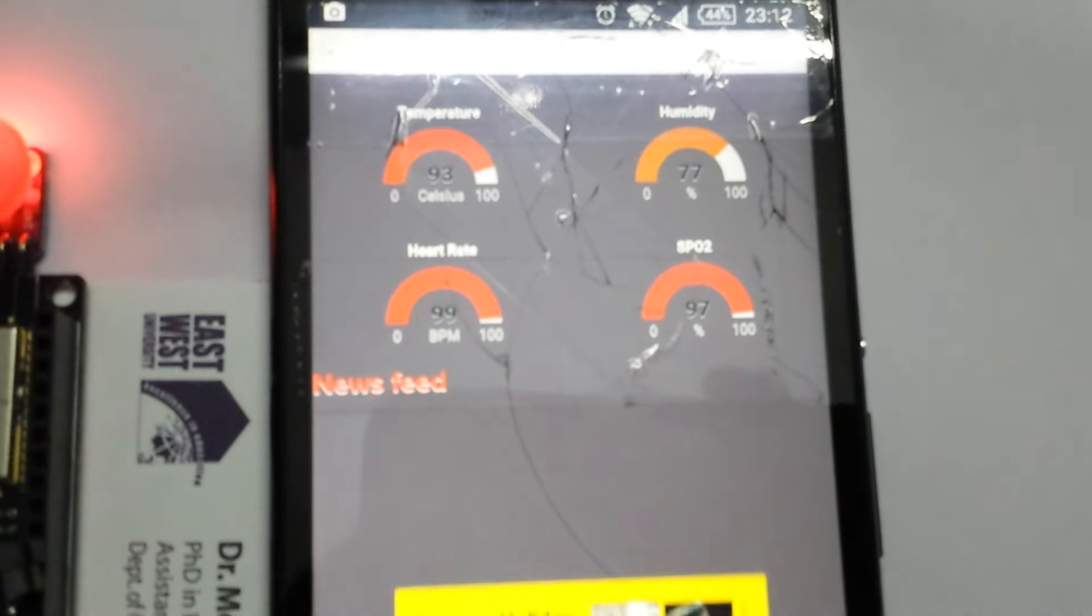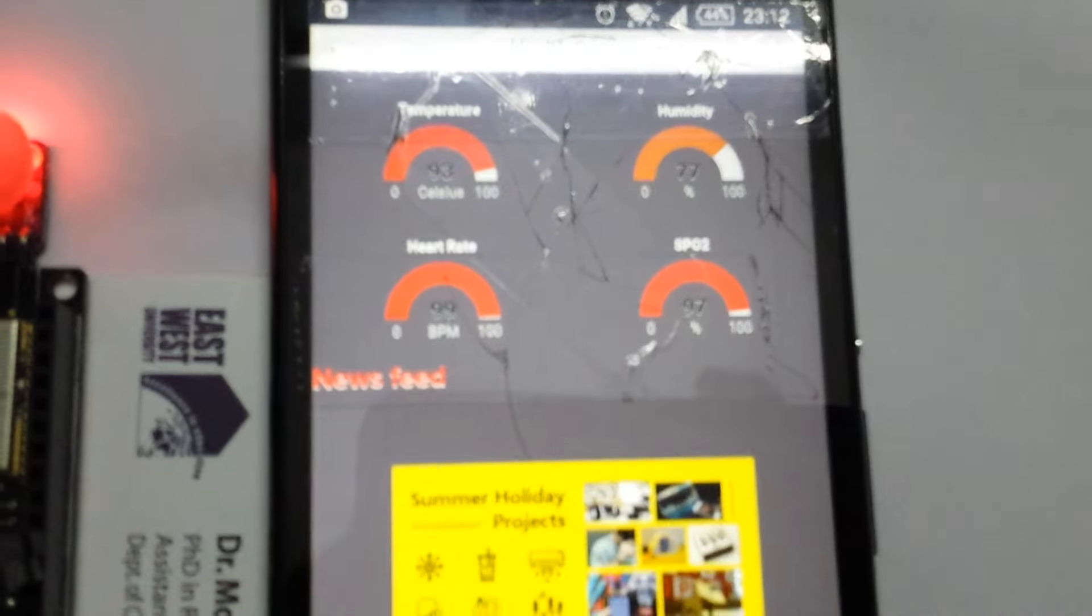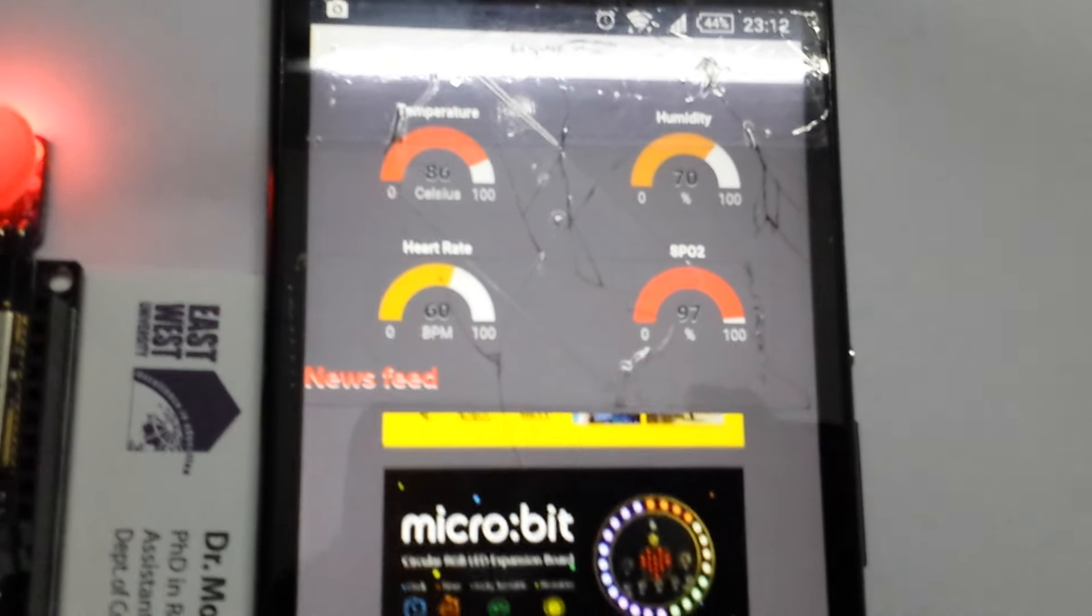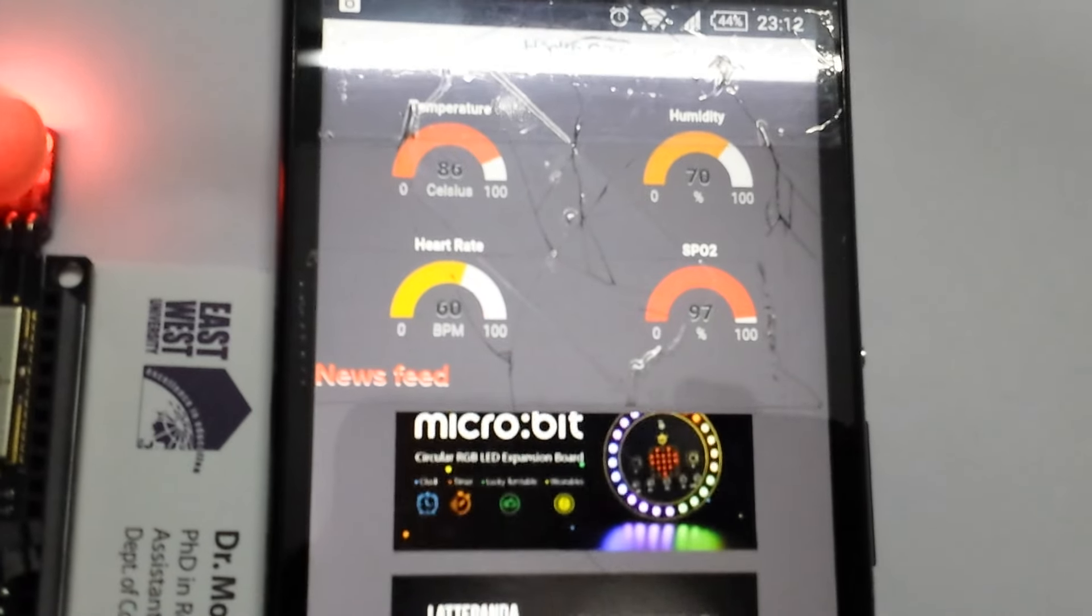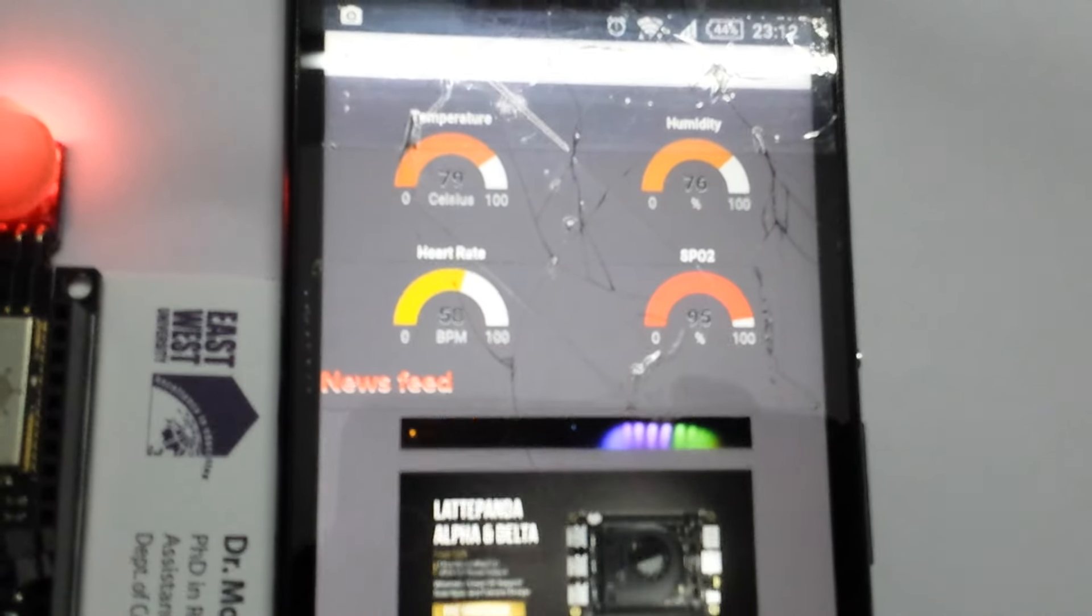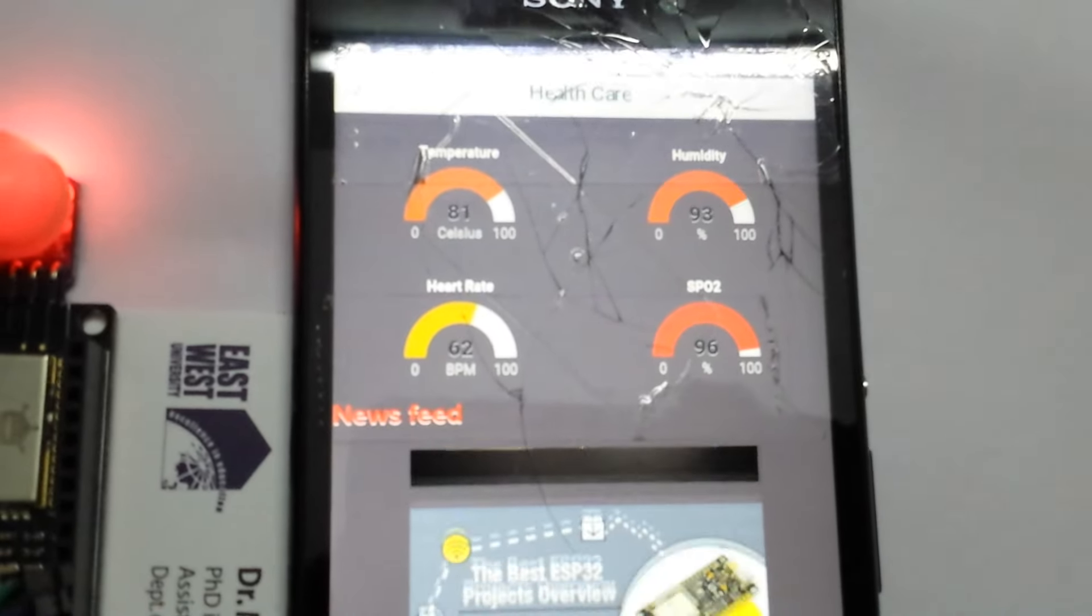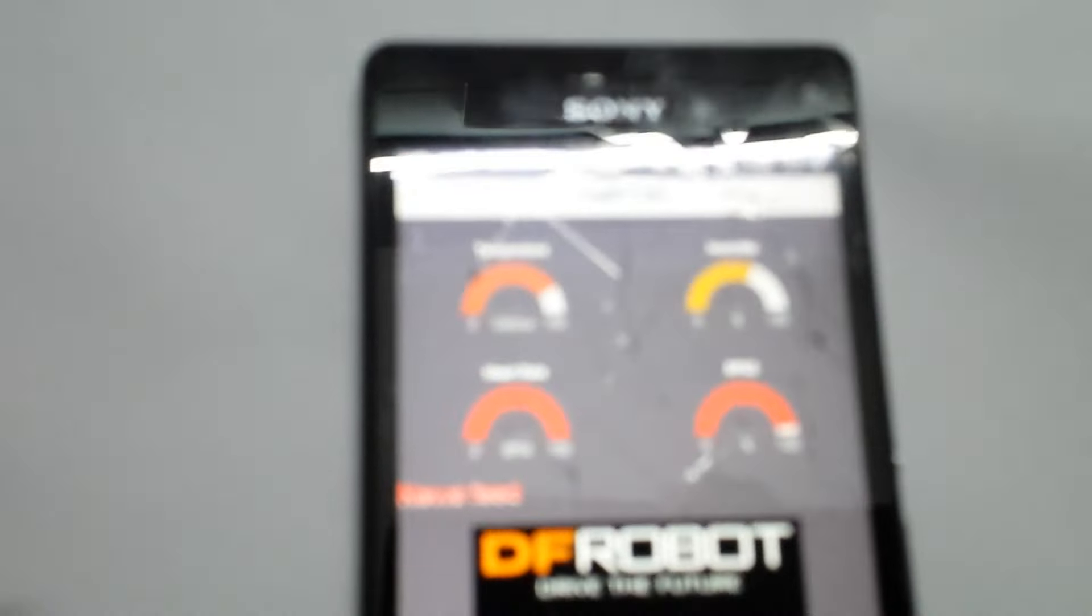The heart rate and SPO2 are changing. Other than SPO2 and heart rate, there are some other features.